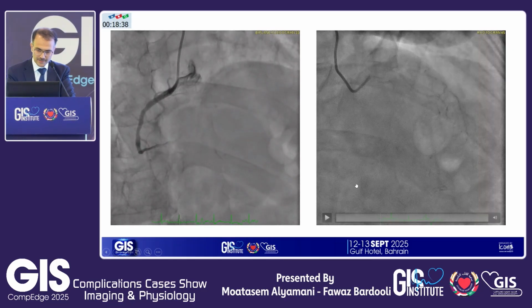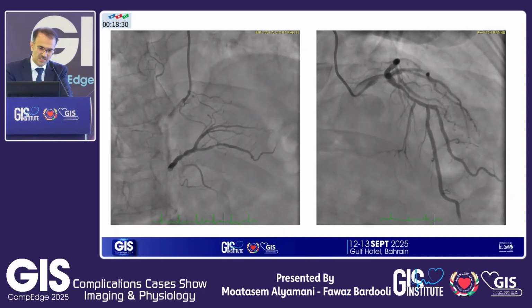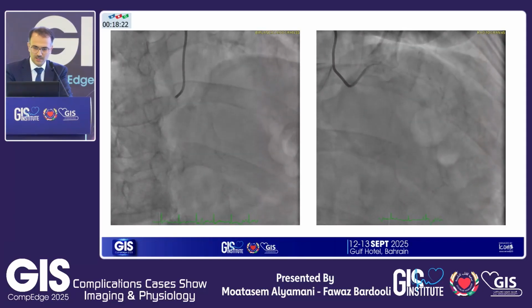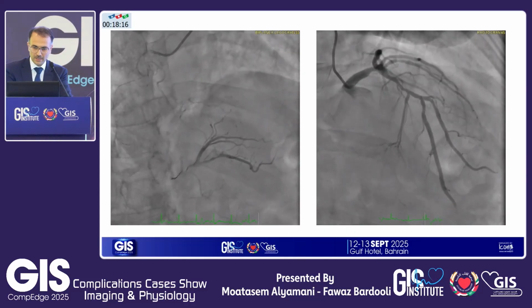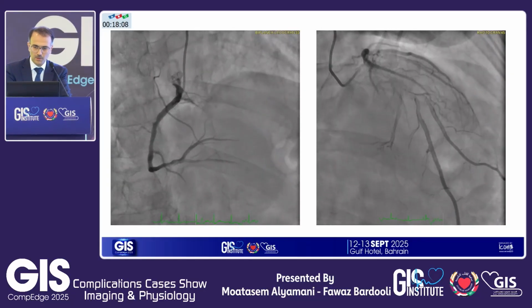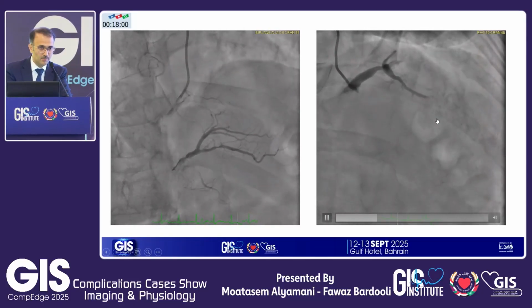This is his RCA. And this is his LAD. So RCA, there is some distal PDA, crux and PDA disease. And then you have the left system, very dominant LAD. You have big left main, quite long. There is some disease distal to that. And then you have proximal, probably something relatively fine, and then you have a long disease affecting the LAD diagonal bifurcation.